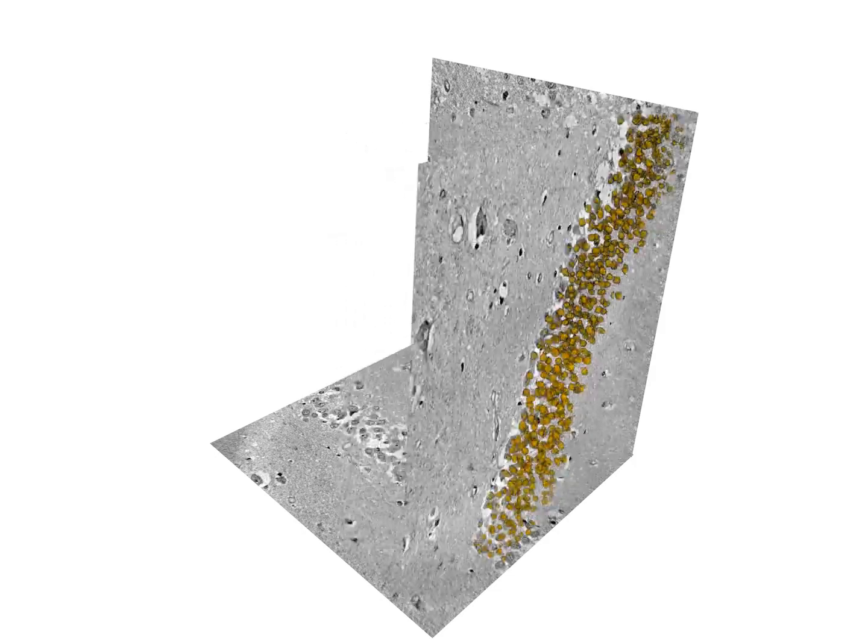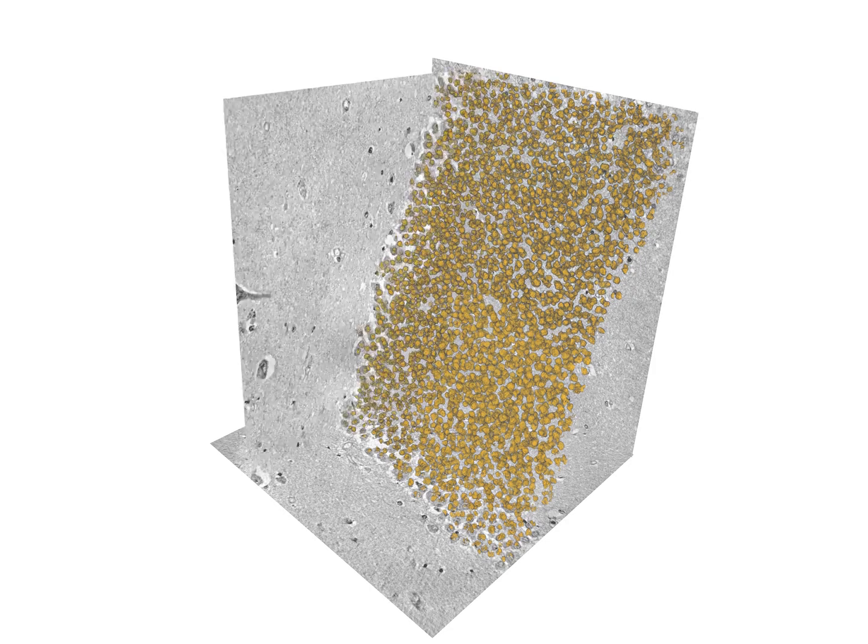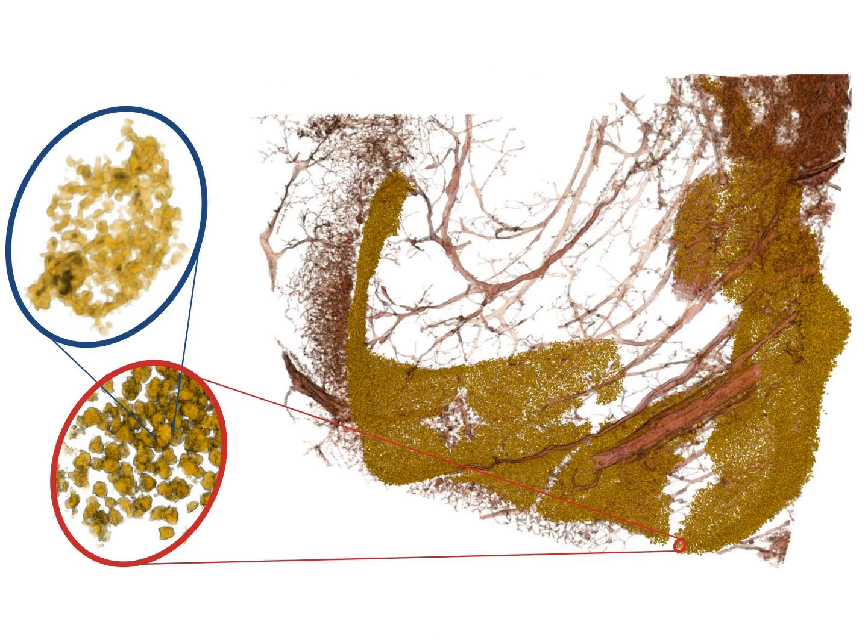For our computational analysis, the first step will be image segmentation. This means we try to identify objects in the image with a distinct structure and boundary. This will typically be cell nuclei, other organelles, and blood vessels. By manually marking some of them, an algorithm can be trained to automatically segment the rest of the data. Here you can see a segmented tissue sample with nuclei and blood vessels. The red and the blue ellipses show zoom-ins onto smaller sets of nuclei and even an individual nucleus. The segmentation step in itself is an active field of research, with many scientists working to continually improve these methods.